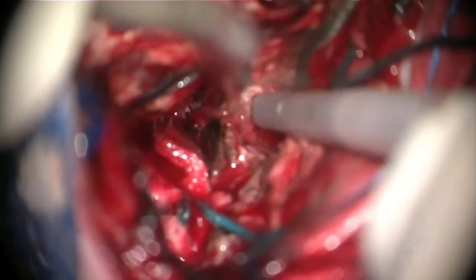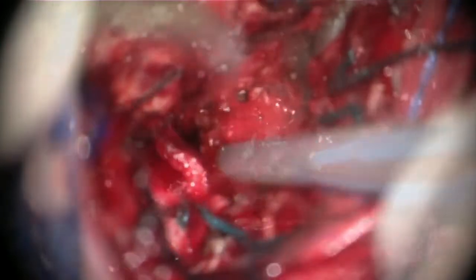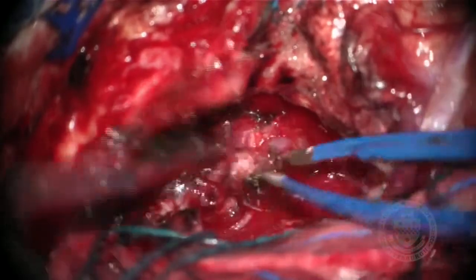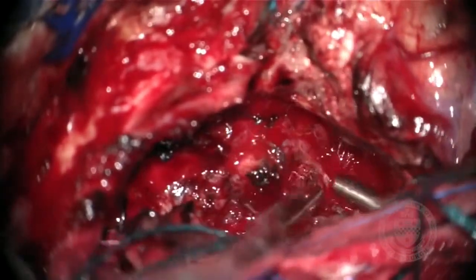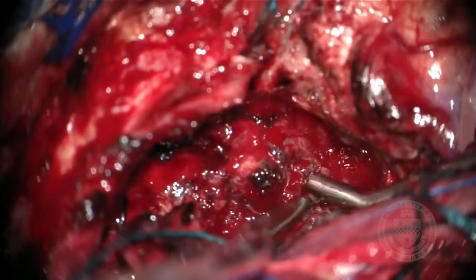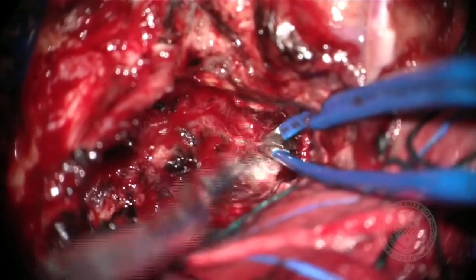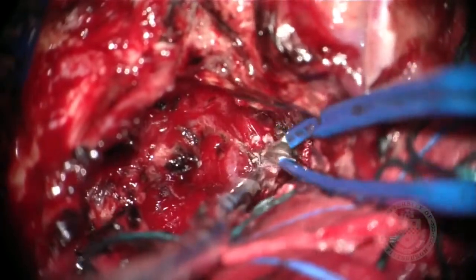We are working now anteriorly, resecting the tumor with the ultrasonic aspirator. Here we see one of the PCA branches that we are now using the Doppler to map. But this is clearly a large inferior temporal artery that is feeding the tumor and has to be transected.